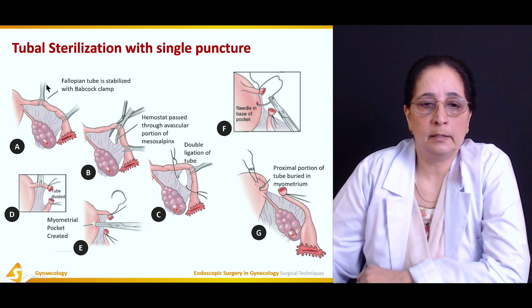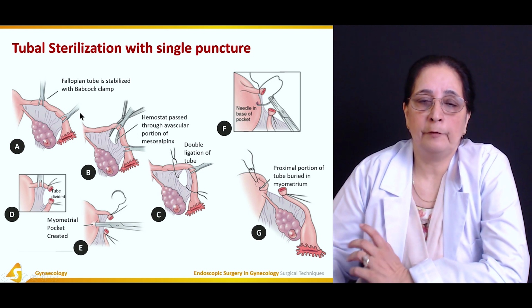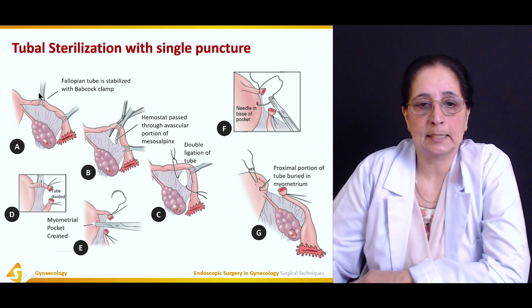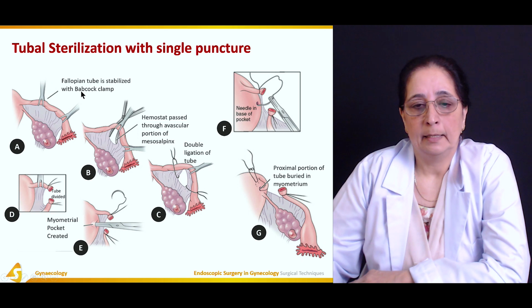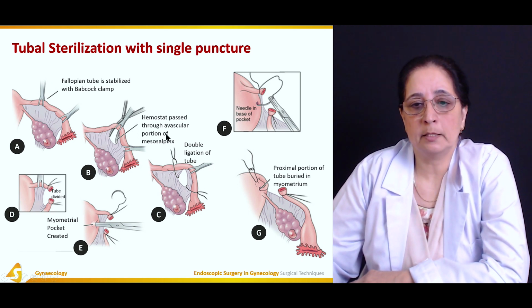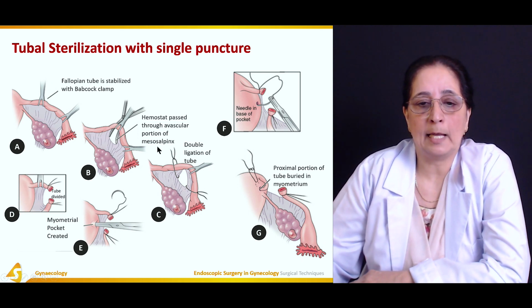Here, these are the clamps, and the fallopian tube is held in between the clamps, so it cannot move.